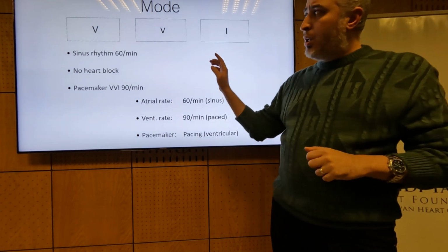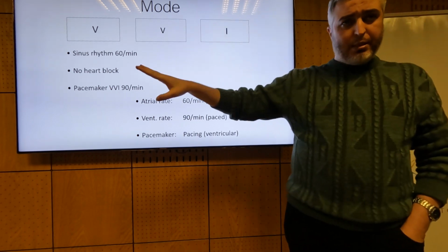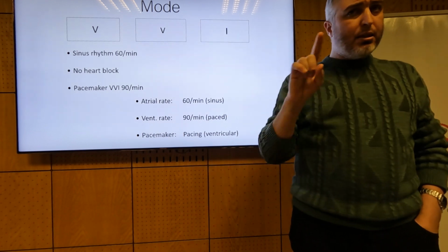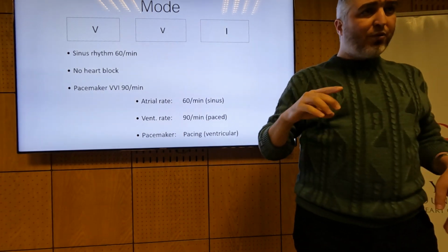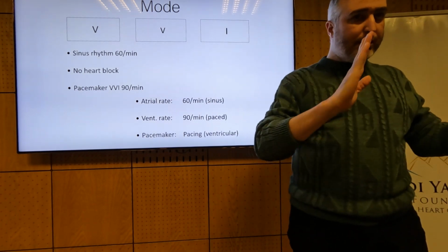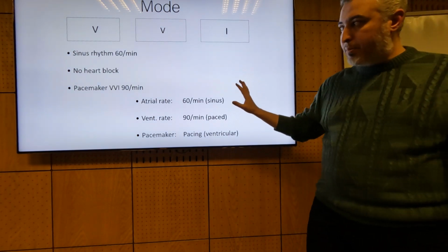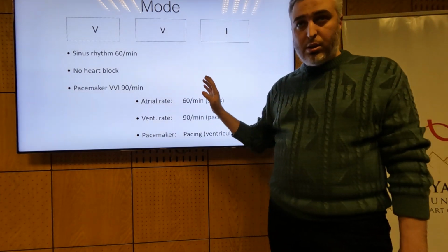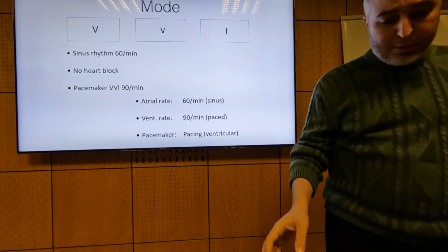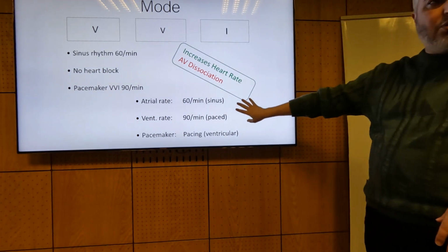Essentially, patients on long-term VVI pacing, I mean permanent pacing, eventually end up with pacemaker-induced cardiomyopathy because of that long-term inefficient ventricular contraction, interventricular and intraventricular. Okay, so this is not an ideal situation, but you're still able to increase the heart rate, at least during the temporary period. You can increase the heart rate, but you get AV dissociation.